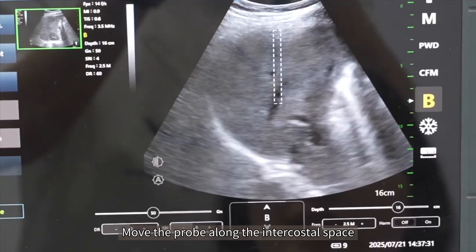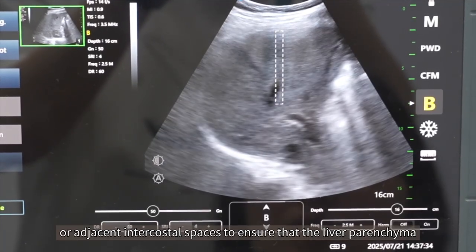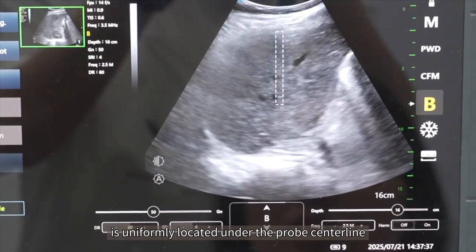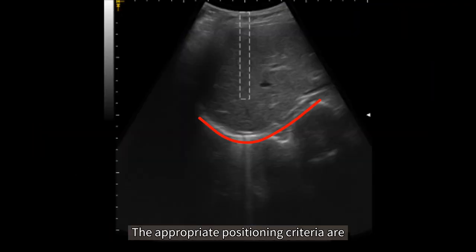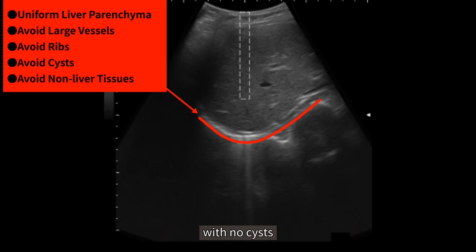Move the probe along the intercostal space or adjacent intercostal spaces to ensure that the liver parenchyma is uniformly located under the probe centerline. Avoid large blood vessels, hepatic cysts, and other organs to obtain more accurate values. The appropriate positioning criteria are uniform liver parenchyma below the probe centerline, within the dotted line, with no cysts, large blood vessels, ribs, or other non-liver tissues.